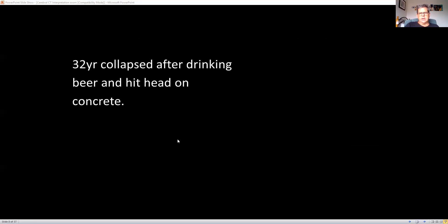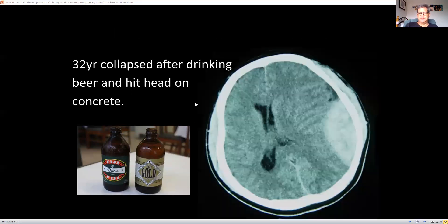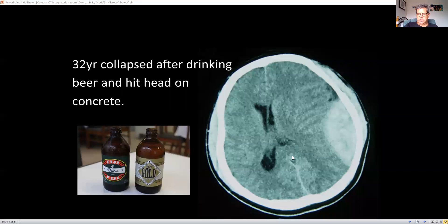Here's another extradural example. A 32-year-old collapsed after drinking a beer and smacking his head on concrete. You can see that characteristic appearance of an acute extradural hematoma, with compression of the surrounding tissue, midline shift, and effacement of the lateral ventricle. We're not on a bony window so we can't see the overlying fracture, but it will be there. This is a neurosurgical emergency.